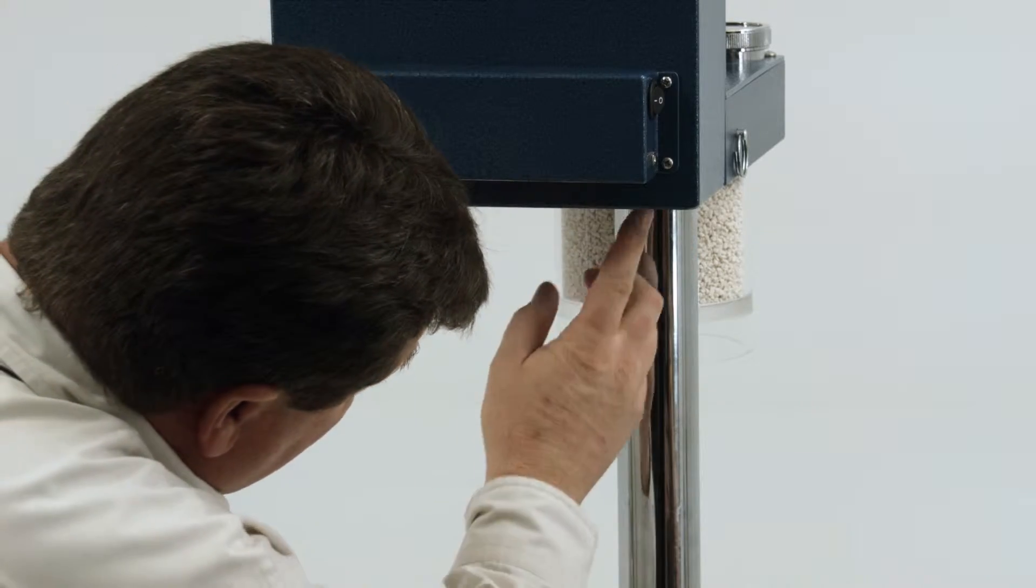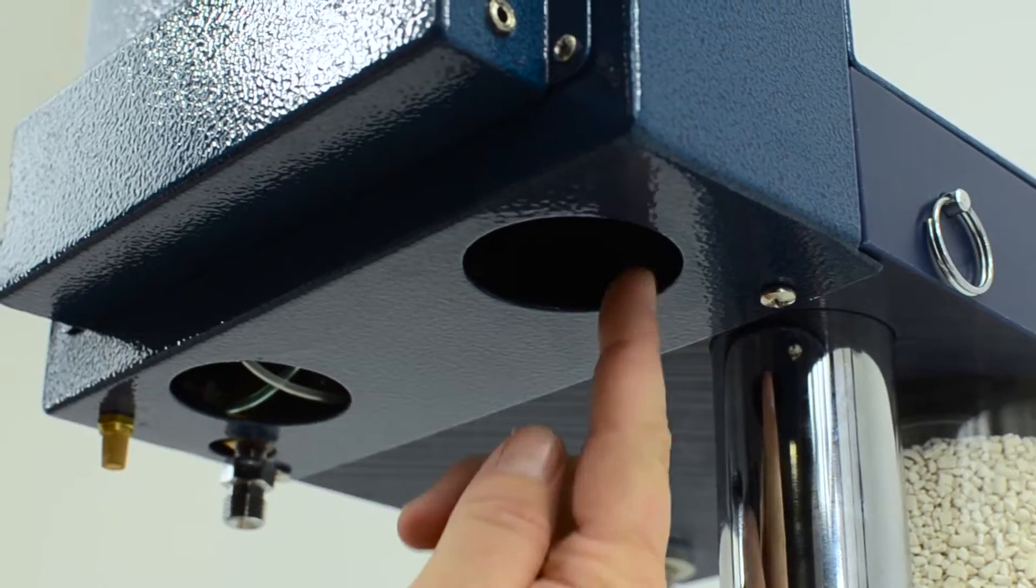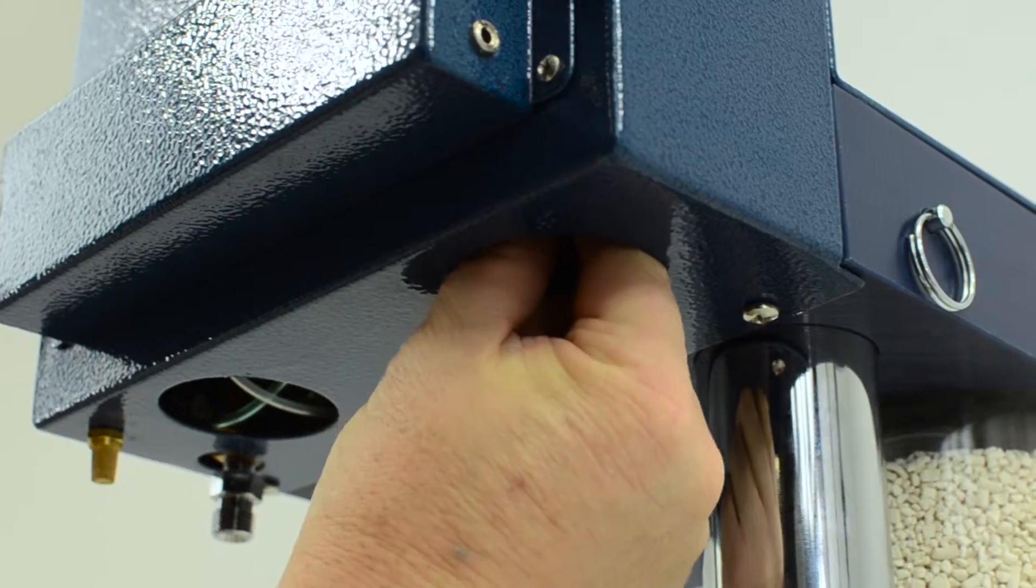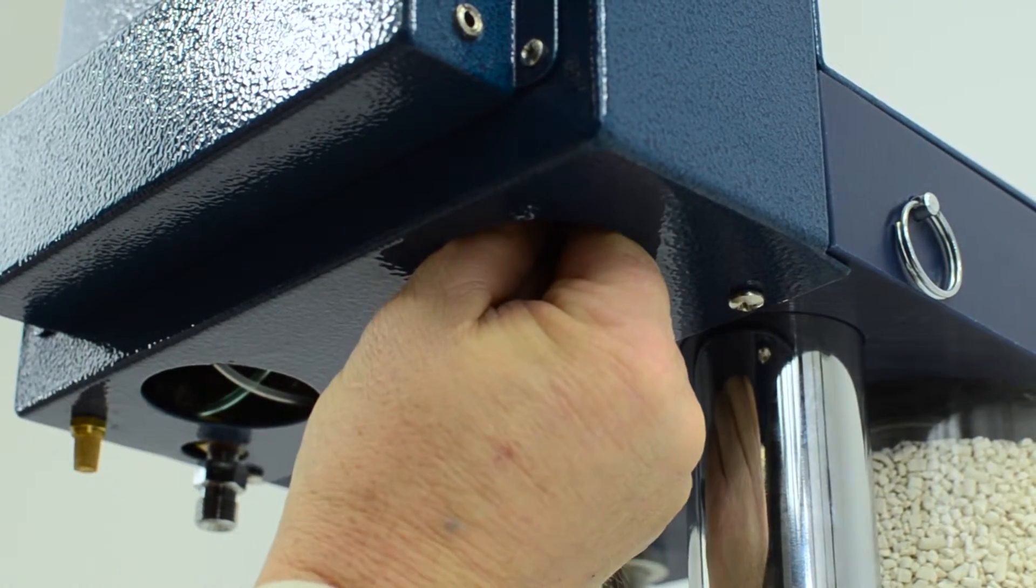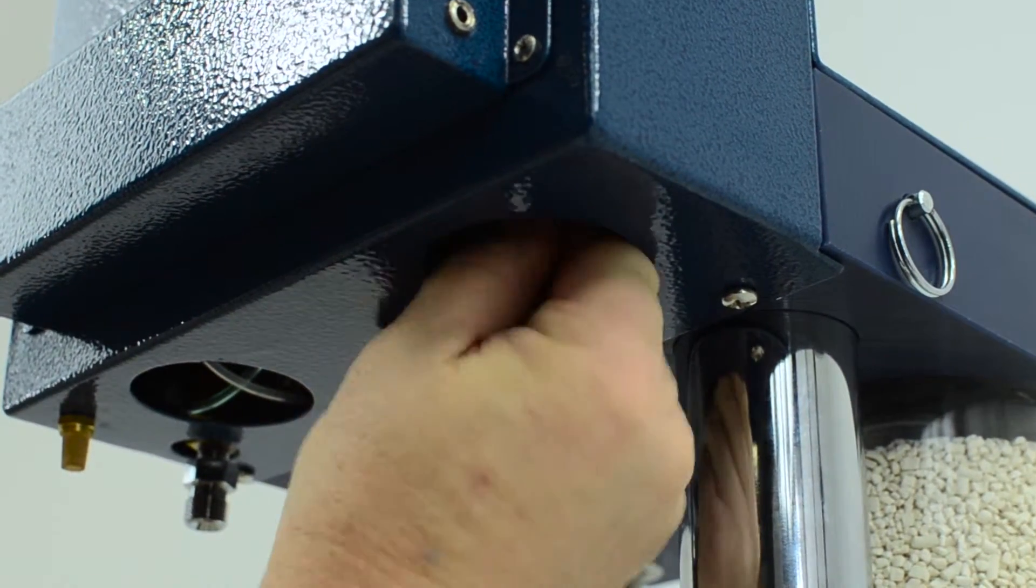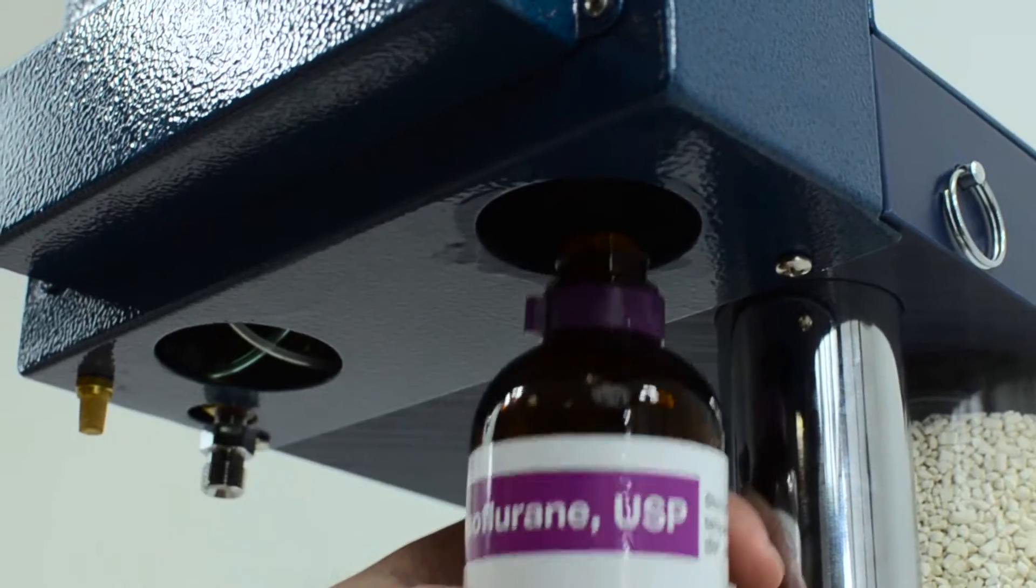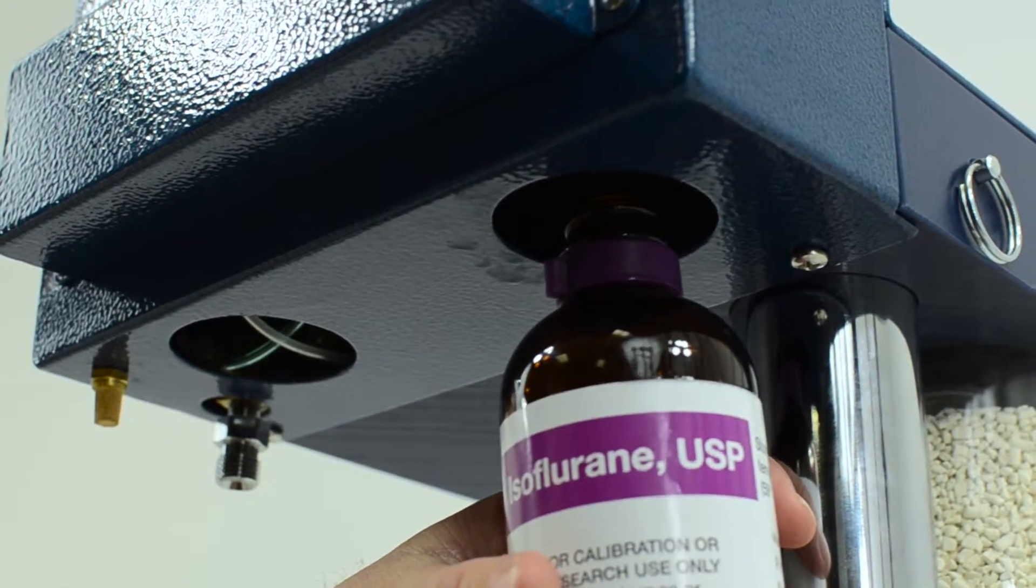You'll remove the black cover plug here and you'll reach up and you'll feel a little rubber nipple plug. You'll pull this off the bottom of the vaporizer and your drug will drain out then into the bottle.